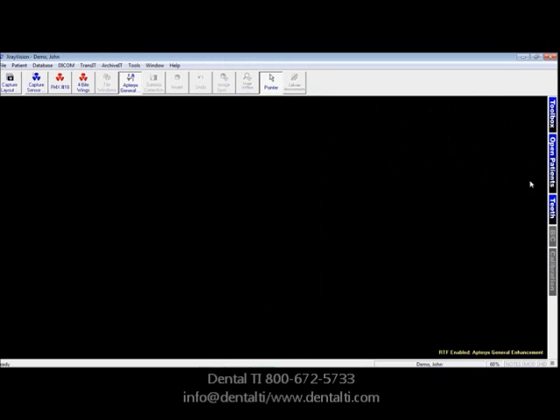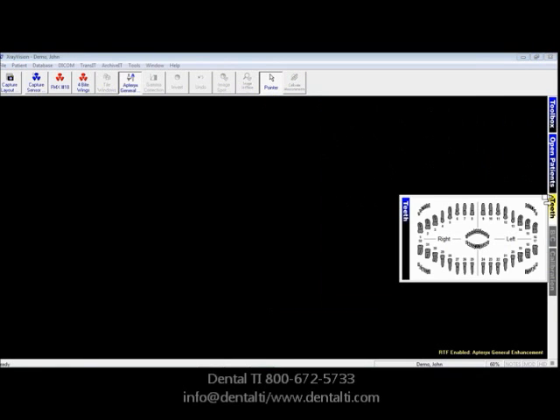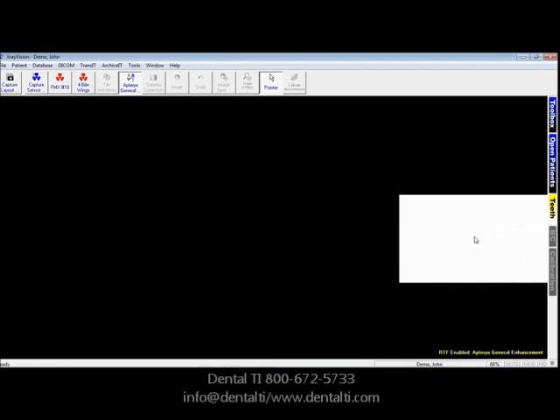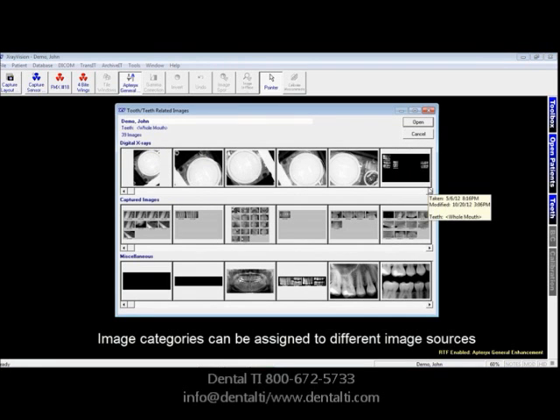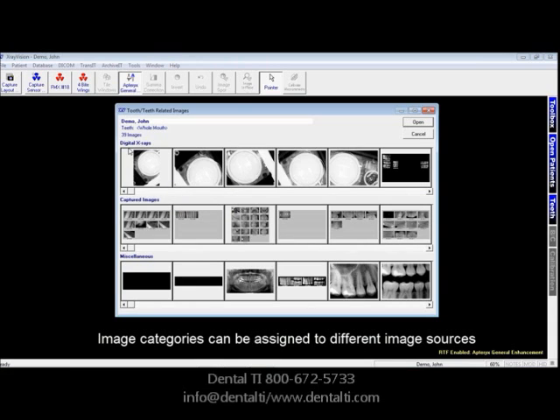The other option in Teeth is to simply click in the middle of the two arches, and that will allow you to see every image. Images are categorized as digital X-rays, captured images, and some images might have a category of miscellaneous assigned to them.